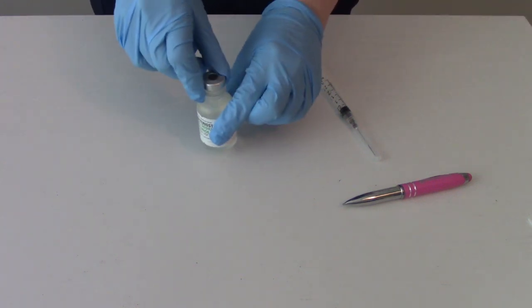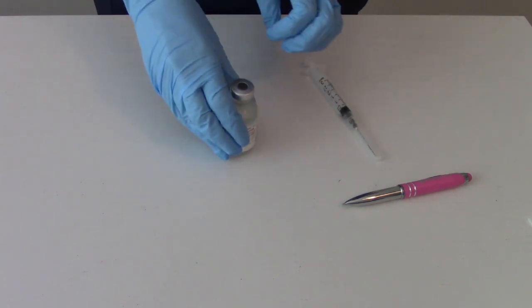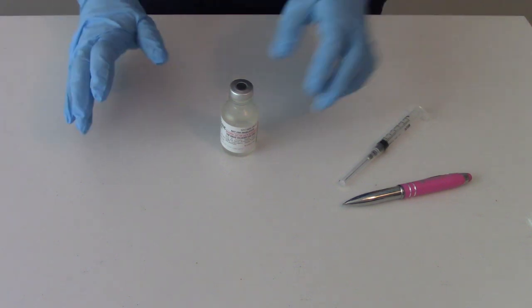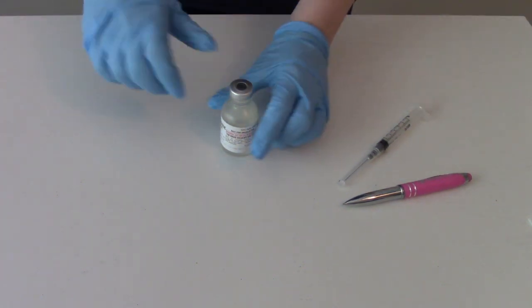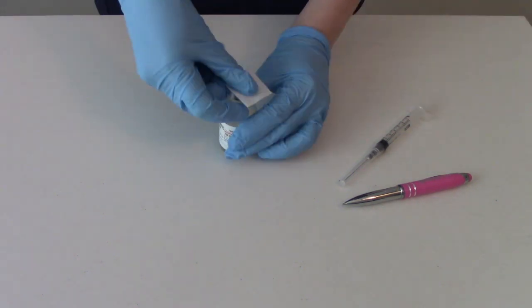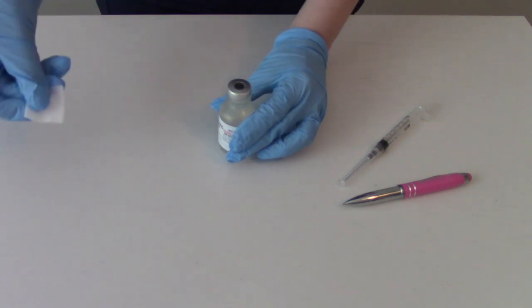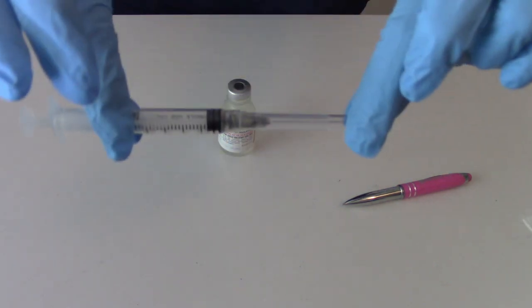This is a vial I've used before, it's not really real, it's just for demonstration purposes. Let's just pretend it's a vaccine, like we're going to give the flu shot or something like that. We would pop off the top if it had a top on it, wipe it with the alcohol wipe, and then we would get our syringe and our needle ready.